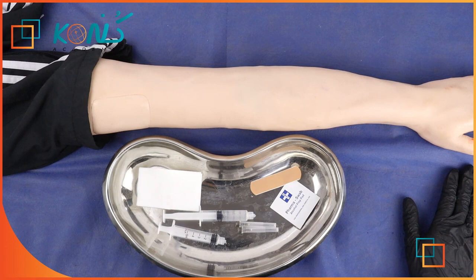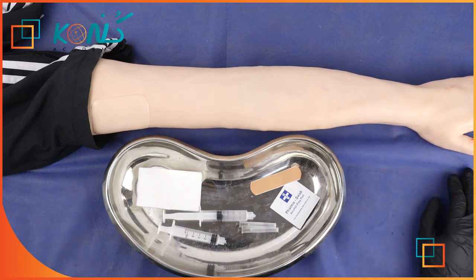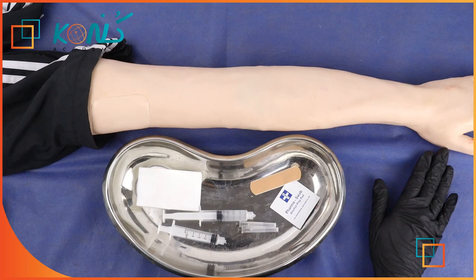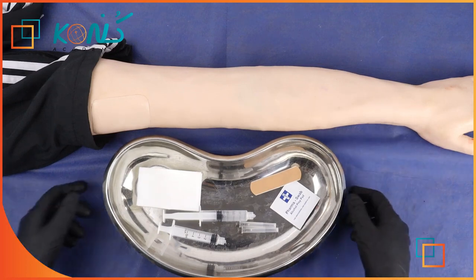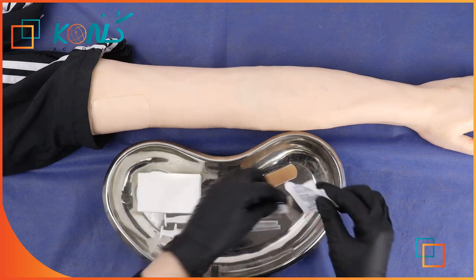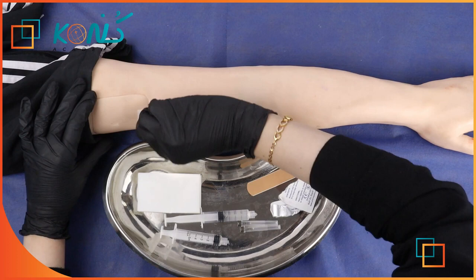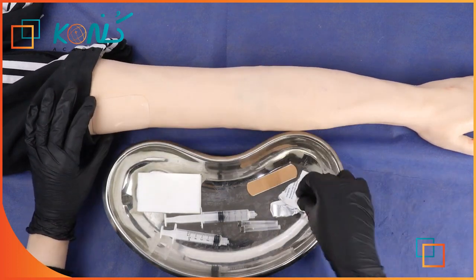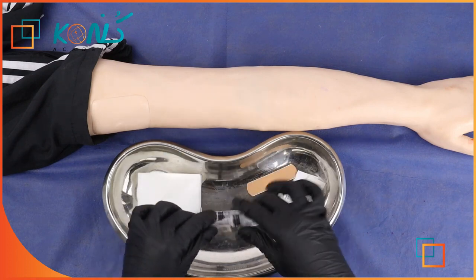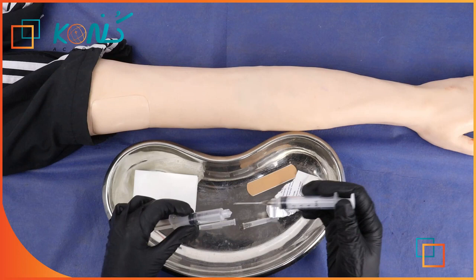By that, you can say, I need you to expose your arm if you are going to give it in the arm. And also, I need you to put your hand on the table, and then you will do the procedure with your colleague. In the beginning, you will clean the skin. Then you will prepare your medication. First needle to take the medication.